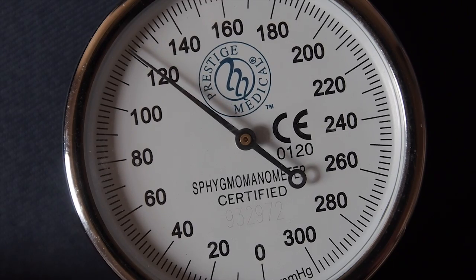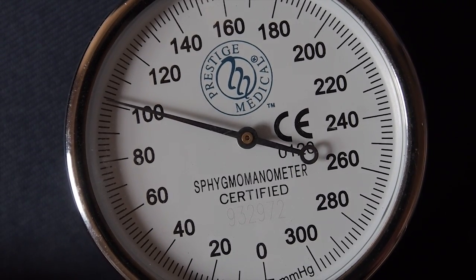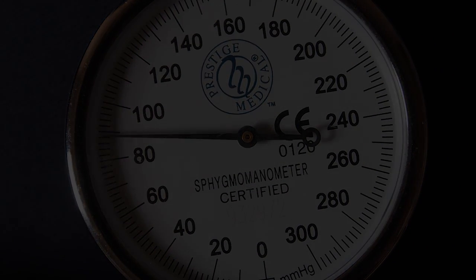A manual blood pressure should be used if the patient suffers from a weak or thready pulse, has severe hypertension or severe hypotension, as some electronic machines can give an inaccurate reading.